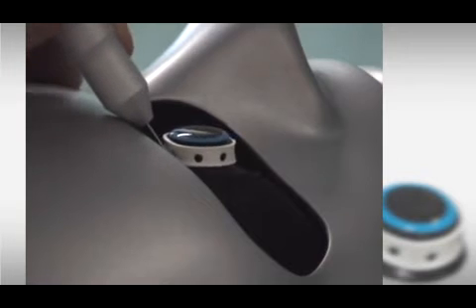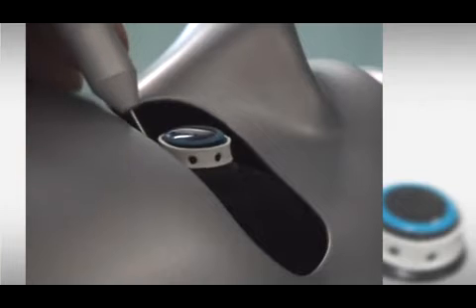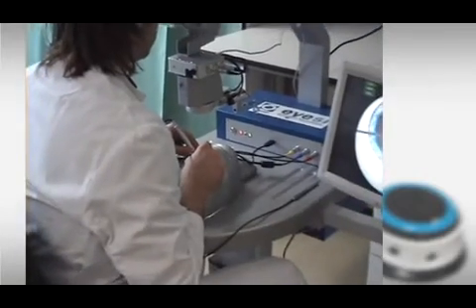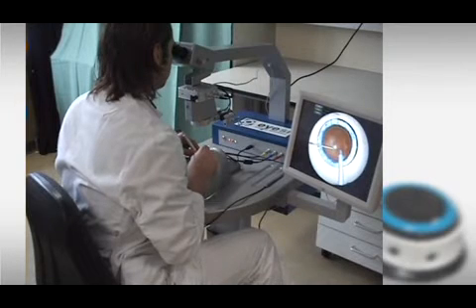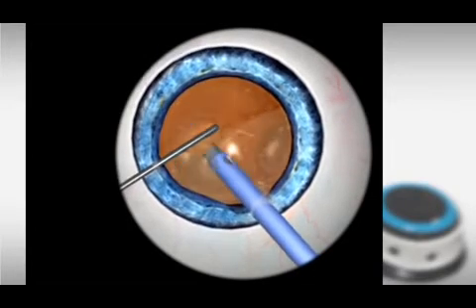After inserting the instrument into the artificial eye, movements are detected by optical tracking and transmitted to a computer that creates a virtual image, which is then presented via the stereo microscope in a three-dimensional mode, including visualization of the red fundus reflex.